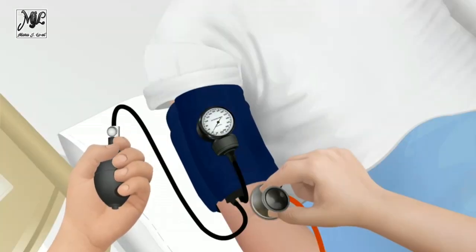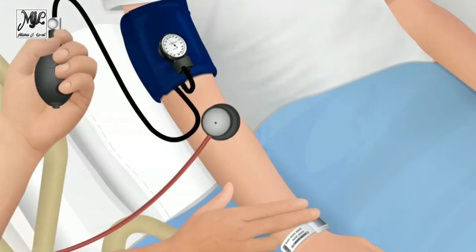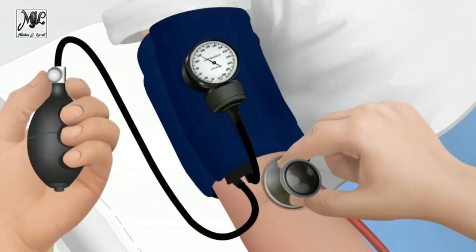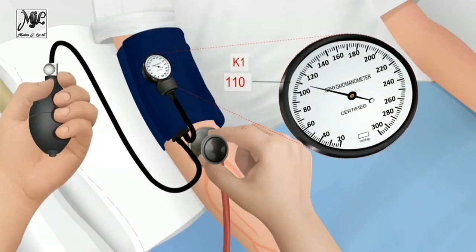Stabilize the child's extremity to limit movement. Inflate the cuff rapidly, avoiding over-inflation. If necessary, estimate systolic blood pressure using palpation before obtaining SBP by auscultation. Partially open the valve and deflate the bladder at two to three millimeters mercury per second, listening to the brachial pulsation. As pressure in the cuff decreases, note the pressure reading on the manometer for the first occurrence of Korotkoff sounds, K1, which indicates SBP.